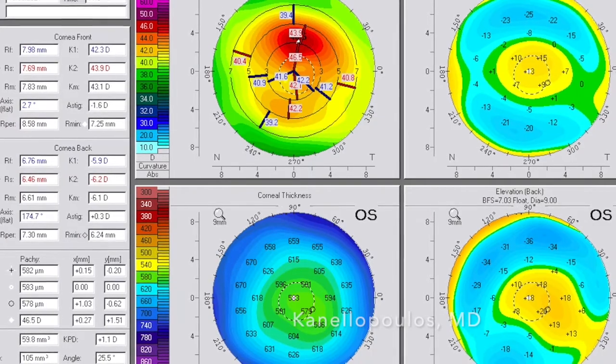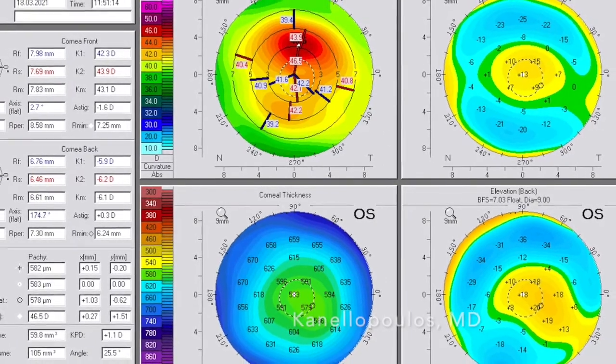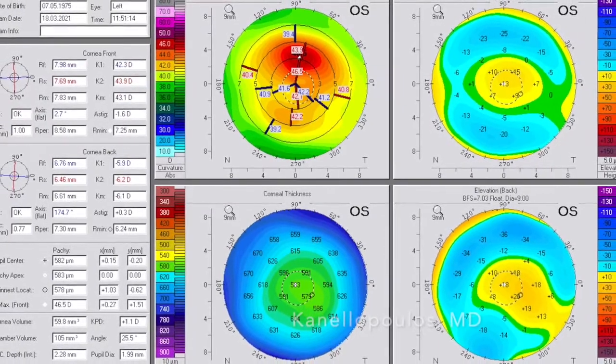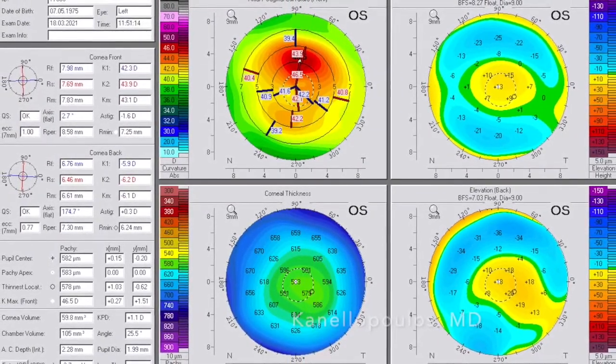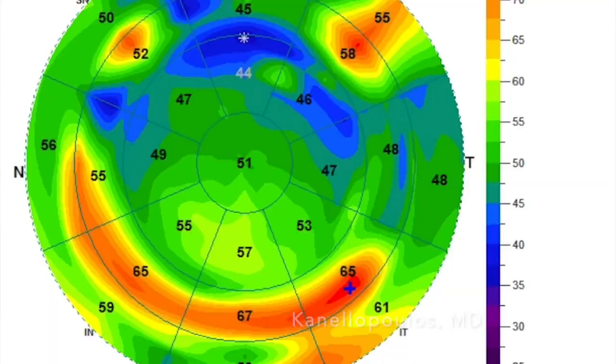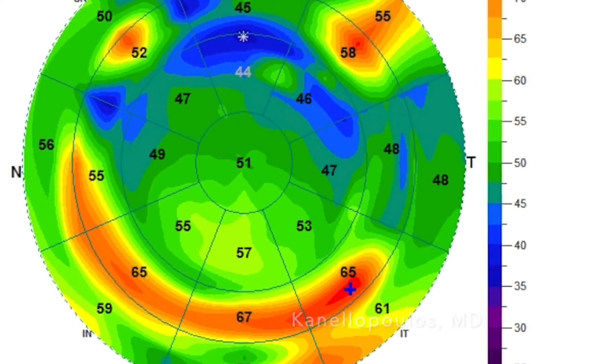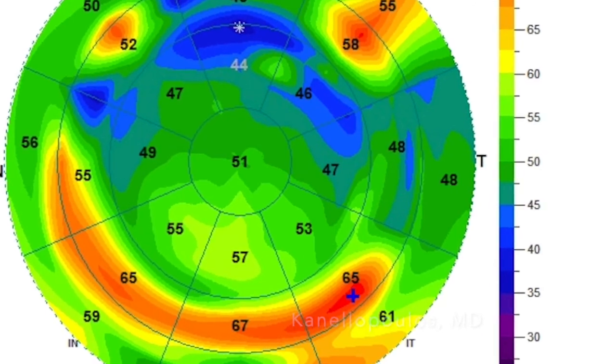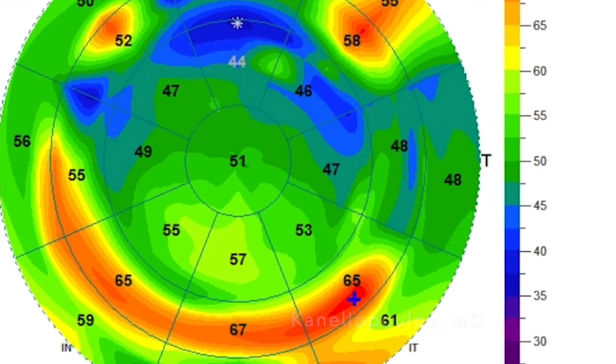We're done. The patient is 20/20 uncorrected. This is a year later. You can see the two-diopter refractive effect — mean corneal power of 43; it was 41 pre-op — and how this holds true through a year. These are the epithelial maps postoperatively, and we can see how the epithelium remodels to cover a little bit more of the hyperopic correction.